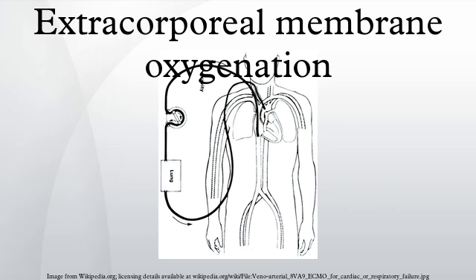Systemic thromboembolism due to thrombus formation within the extracorporeal circuit is an infrequent complication that can be devastating. Its impact is greater with VA ECMO than VV ECMO because infusion is into the systemic circulation. Heparin infusion that achieves its target ACT and vigilant observation of the circuit for signs of clot formation successfully prevents thromboembolism in most patients.